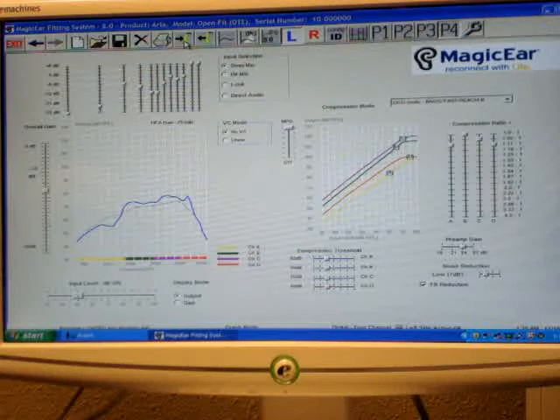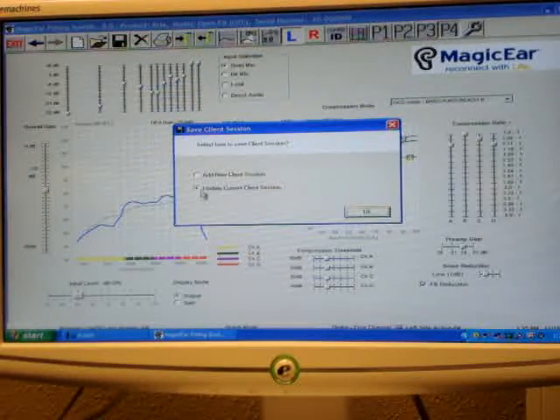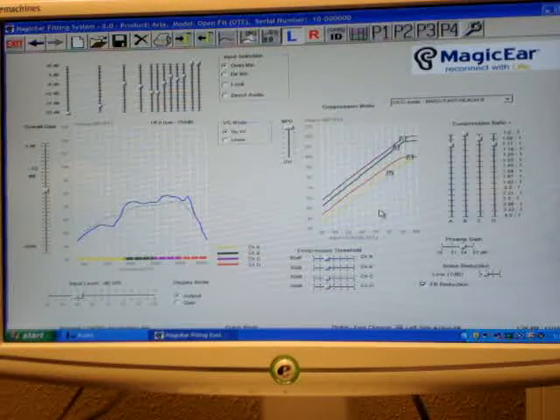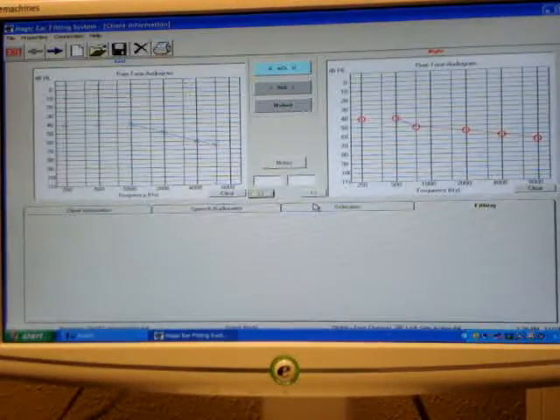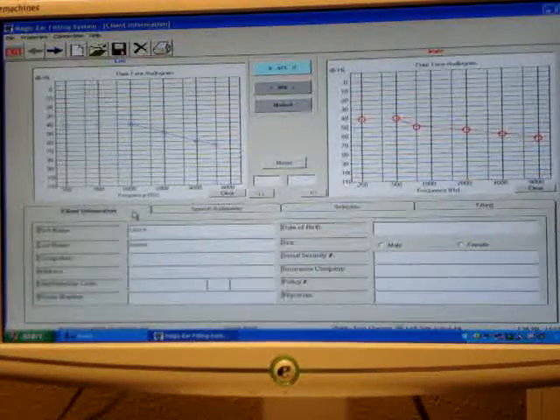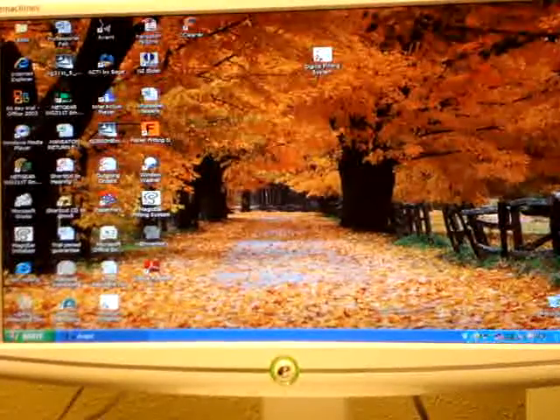And then always make sure you save, and then if you click on this floppy disk file, it will give you your option to save the client session, so you can add a new session or update the current session that you're on. Click OK. So if we went back into the software and you pulled up the client's information, you would be able to pull up the previous setting for the person. Then you can just exit out of the software, and the hearing aids, everything's programmed and saved into them.